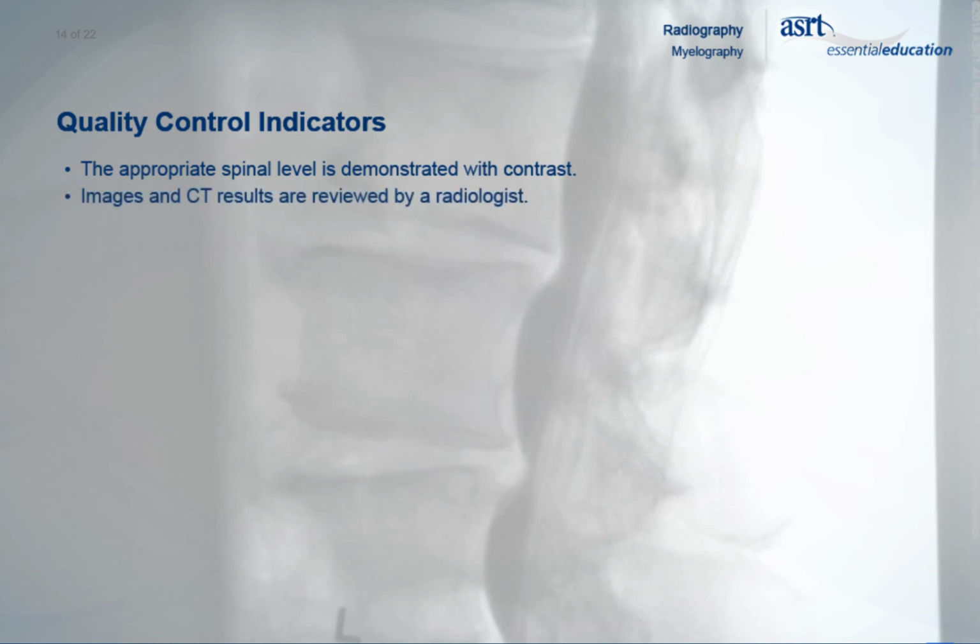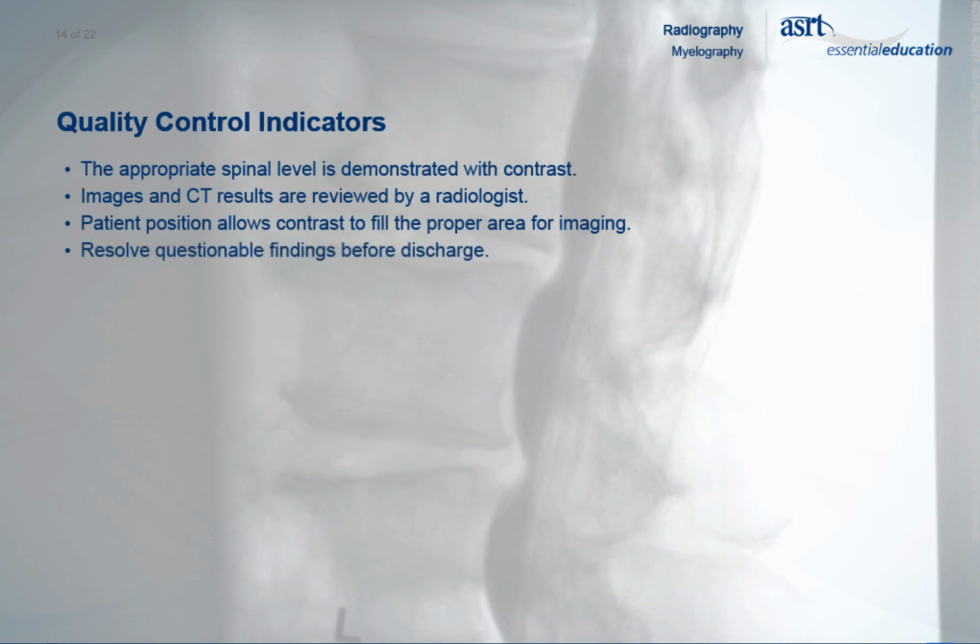To evaluate the quality of a myelogram, verify that the appropriate level of spinal column with contrast medium present is demonstrated on the finished images. The patient's images and CT results should be reviewed by the radiologist to ensure the area is properly opacified with contrast. The patient's position may need to be manipulated to ensure the contrast is in the proper area for sectional imaging. Every attempt should be made to resolve any questionable findings before the patient is discharged, to avoid repeated procedures.